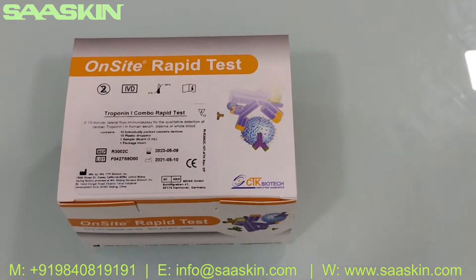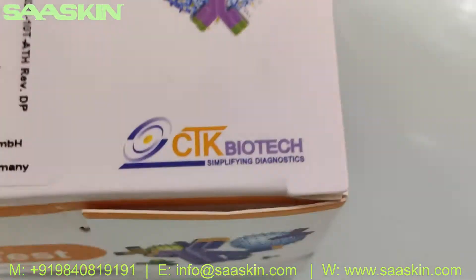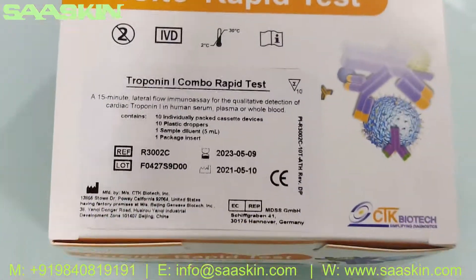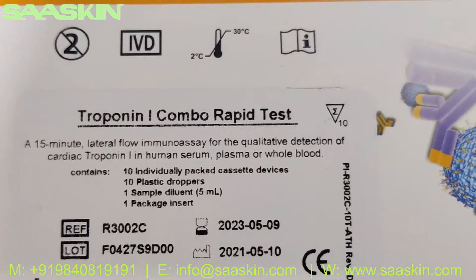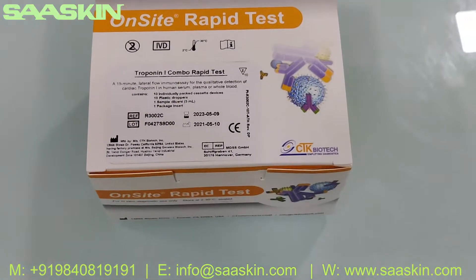Hello everybody, today we're going to see the unboxing of CTK Biotech OnSite Rapid Test for detection of cardiac Troponin I in serum, plasma, or blood. This is the rapid test kit — OnSite Rapid Test kit.